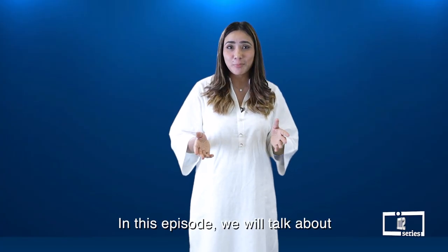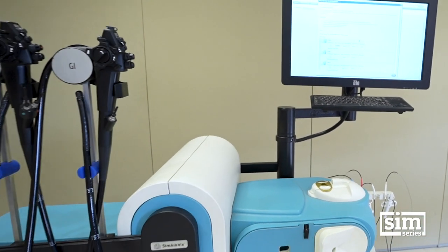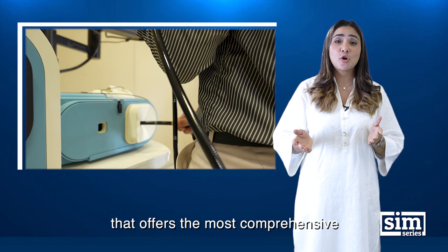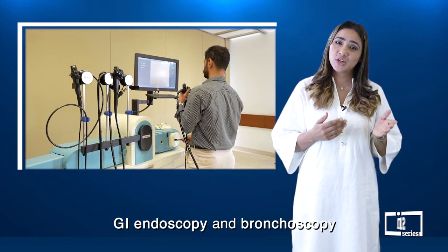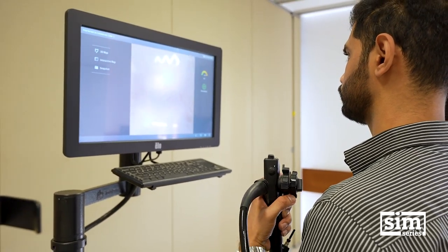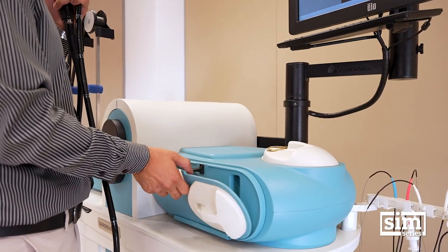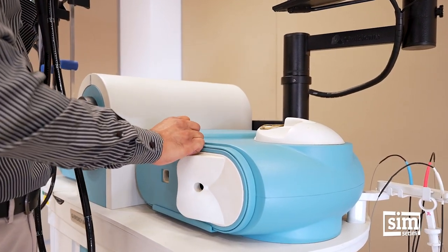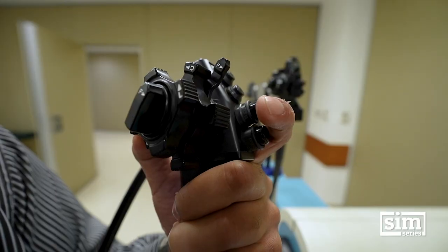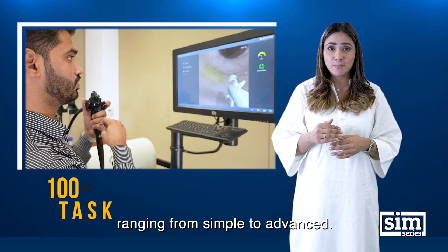Hi, welcome to Sim Series. In this episode we will talk about GI BroncMator. This is a surgical simulator that offers the most comprehensive hands-on training for both GI Endoscopy and Bronchoscopy. This simulator provides multiple training opportunities with true-to-life patient care scenarios. It gives a unique education environment with its 3D perception and 100 plus tasks ranging from simple to advanced.